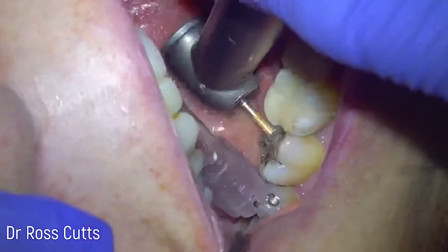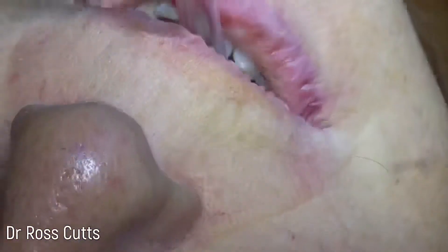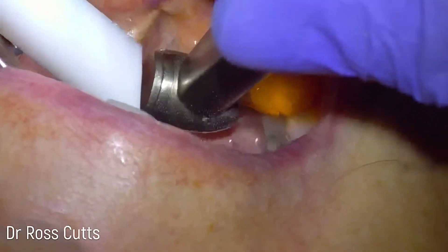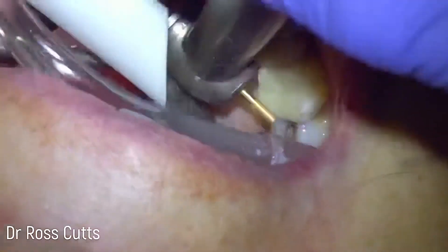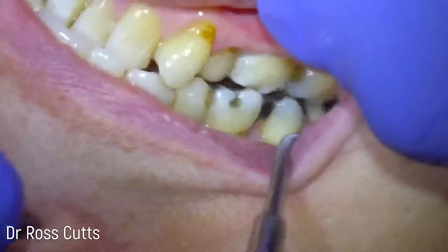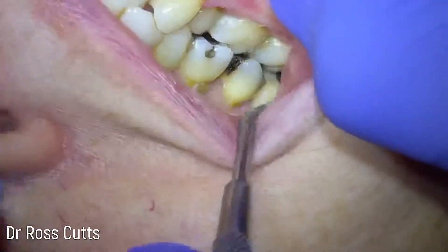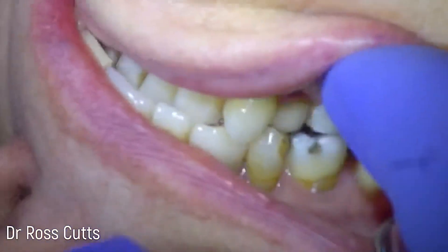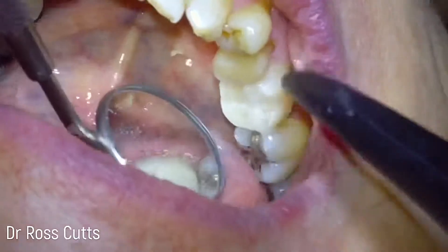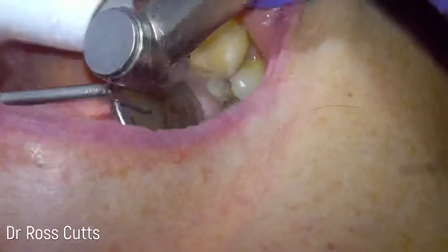We can see here I've over-contoured and over-built the distal aspect of the tooth. There are many little techniques we can use to copy the anatomical form of teeth from what they were previously, but in this case I've just free-handed it because I wanted to recreate a new anatomical form. So lots of little adjustments until we get to the final shape that we're happy with.